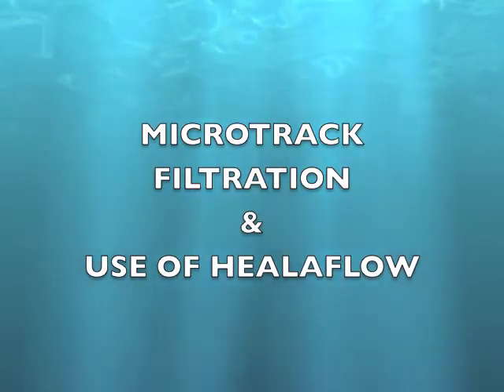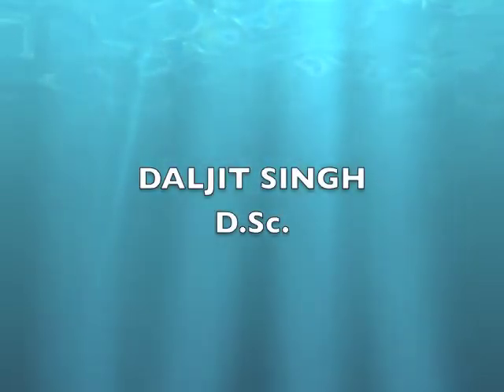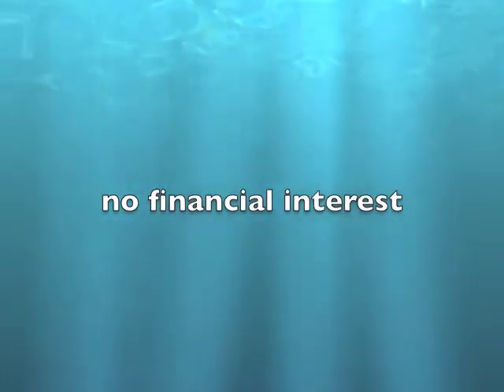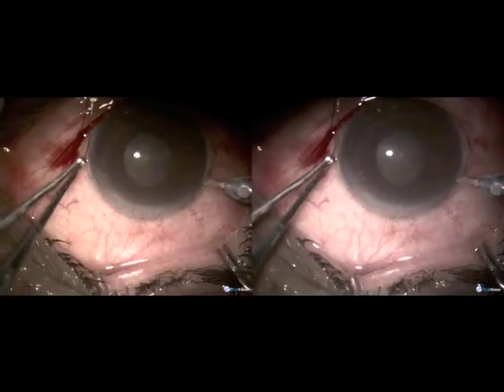Microtrack filtration and the use of Healaflow. Microtrack is done with the help of the Fugo blade. The patient is 65 years old and has primary open-angle glaucoma.